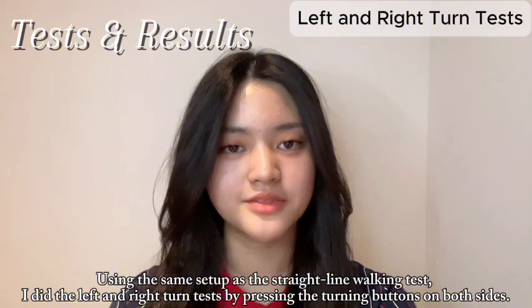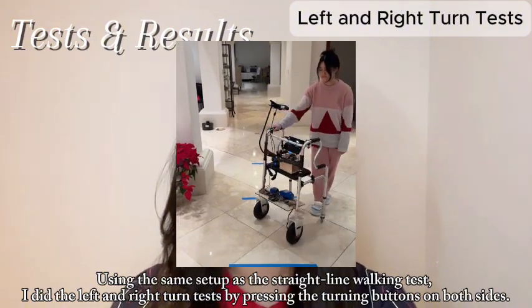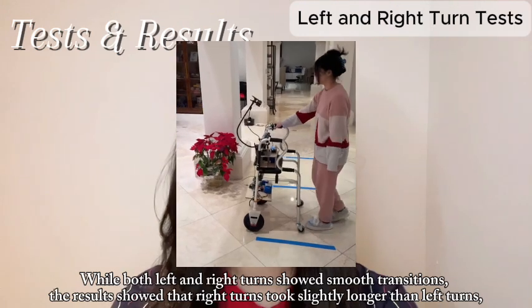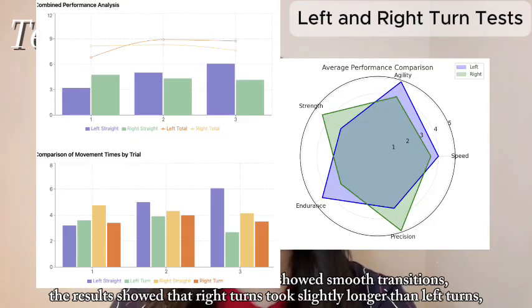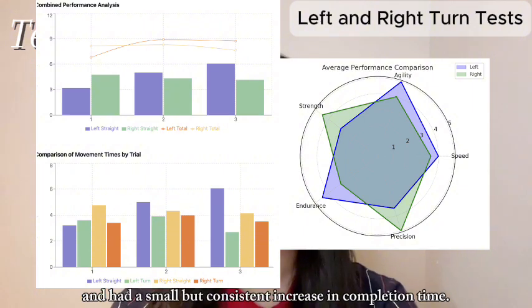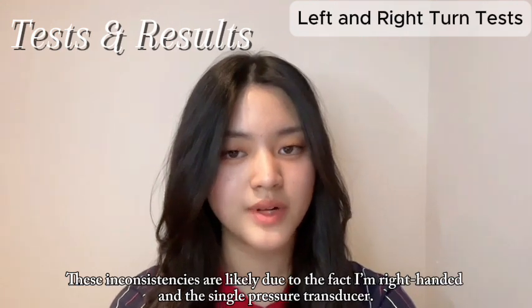Using the same setup as the straight line walking test, I did the left and right turn test by pressing the turning buttons on both sides. While both left and right turns showed smooth transitions, the results showed that right turns took slightly longer than the left turns, and had a small but consistent increase in completion time. These inconsistencies are likely due to me being right-handed and the single pressure transducer.